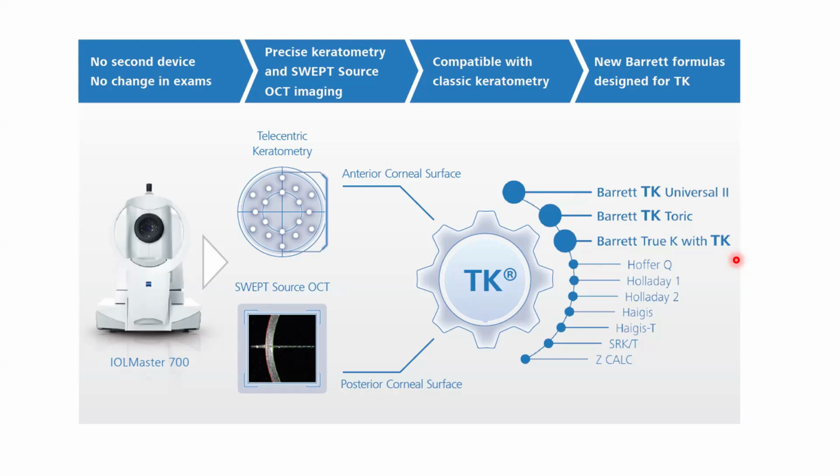The adjustment in the EKR 65 values and the TK values is the same. All of this is being done so that these values can be used with IOL power calculation formulae, which use the refractive index of 1.3375.